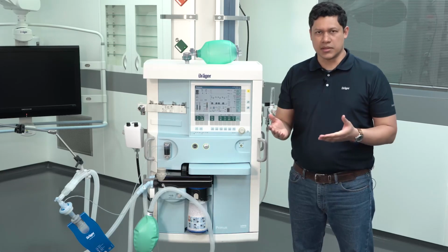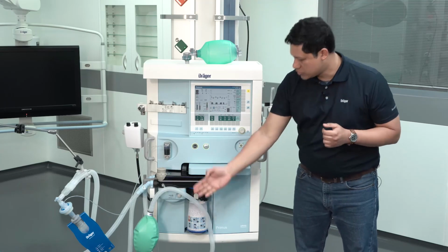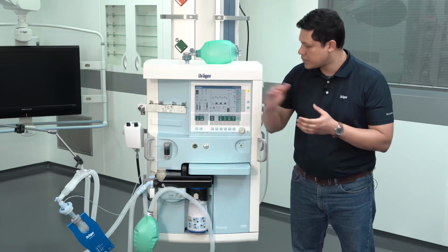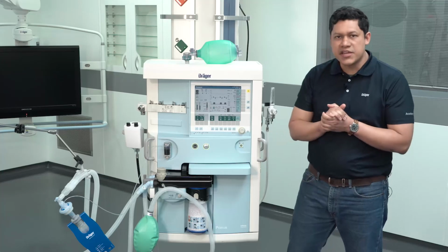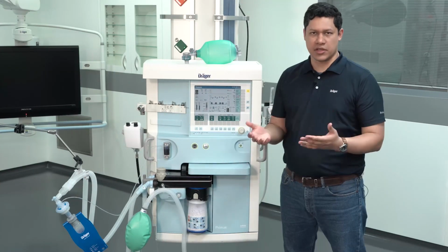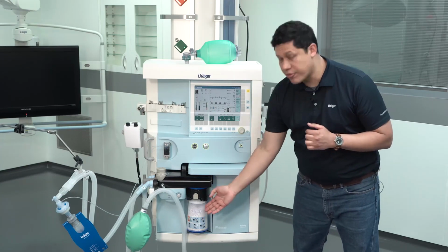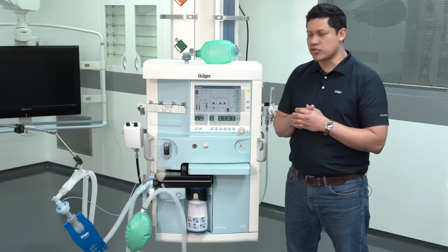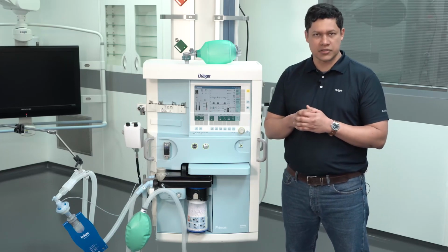It is recommended to check the accessories at least every 12 hours: soda lime canister, gas measurement water trap, respiratory breathing circuits, and patient filter. To verify the condition of the soda lime, visually monitor that no more than 2/3 of its content has turned purple, and that inspiratory CO2 has not gone above a level of 5 millimeters of mercury.